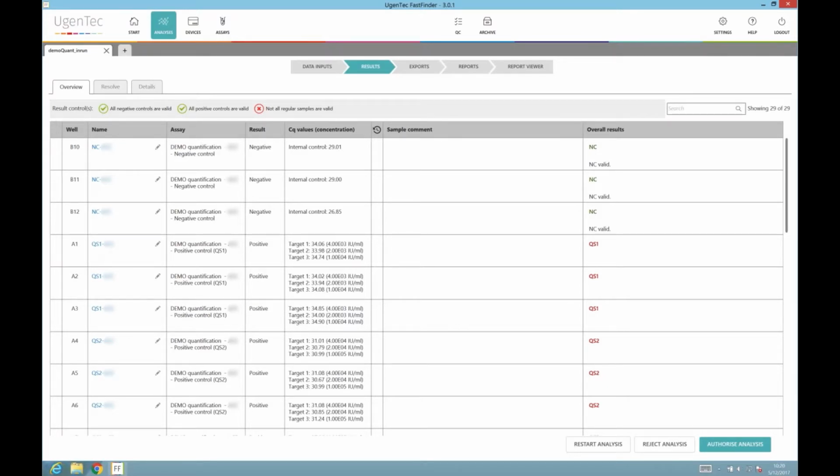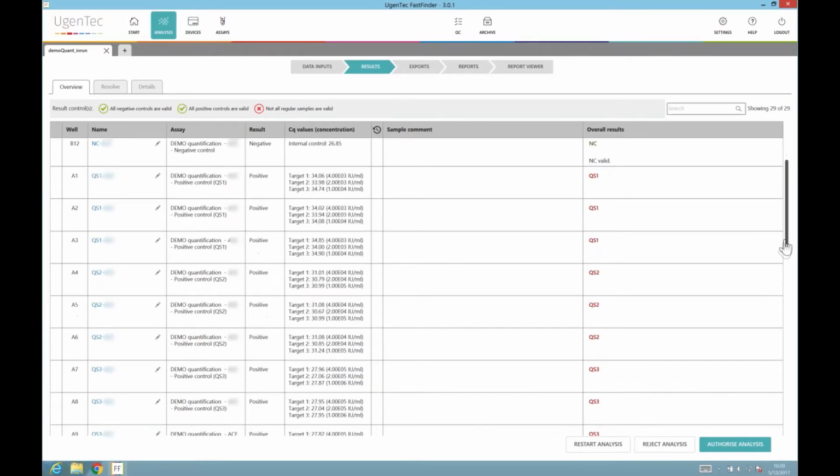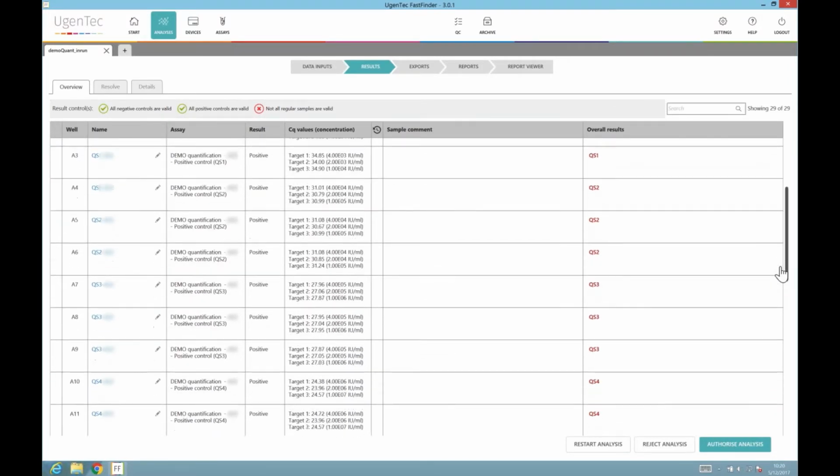And of course, that last little blip there you could see was the implementation of the decision trees. So this is, as someone's mentioned, the conditional stuff about your test that is expressed in your standard operating procedure, or simply trained per technician. What happens if positive control passes or fails, and you get a positive detection of a sample, etc.